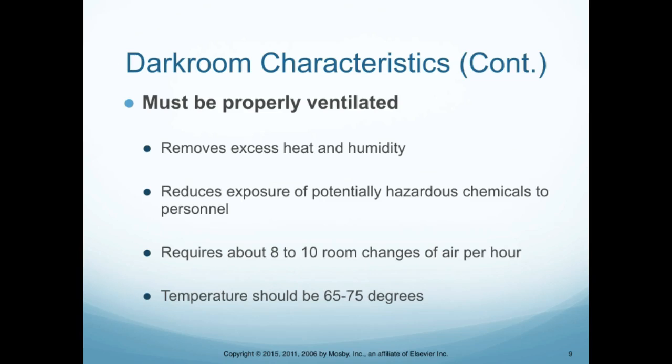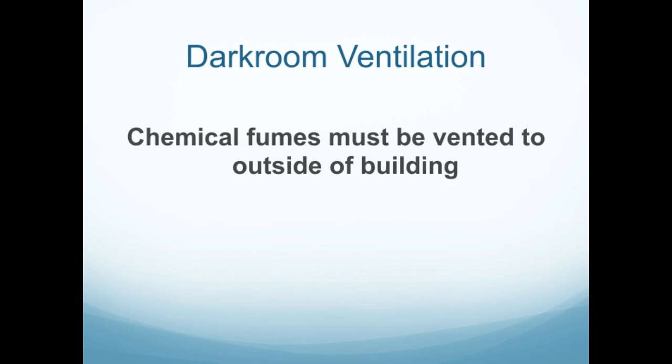It requires about 8 to 10 room changes of air per hour. So I have to have good ventilation there. And the temperature should be 65 to 75 degrees. I will tell you, I got hotter than that many, many times. So the chemical fumes must be vented to the outside of the building. That's something for the contractors to figure out, to get all those lovely fumes out to the outside so people on the outside can smell them.